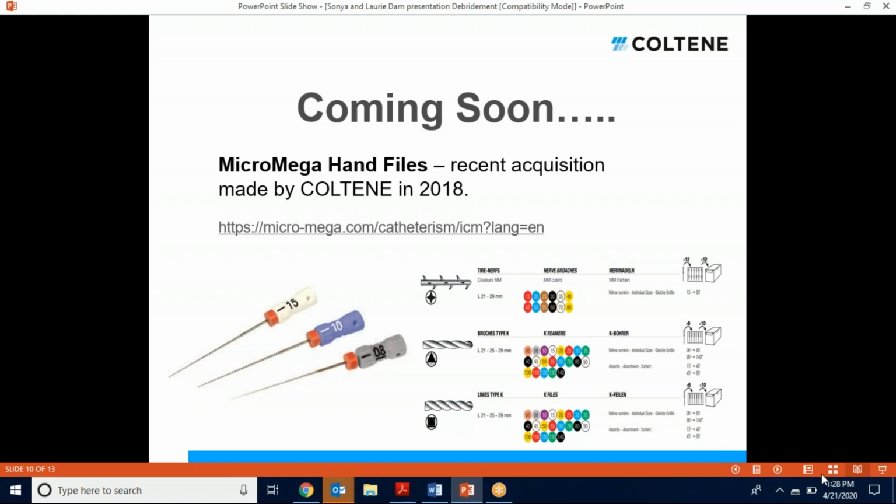All hand files have the ISO color coding, so it's great for easy recognition for the doctors. It's also good for us to know these, at least the most popular sizes, because if a doctor ever says, in which they do, I need a refill of your white hand files, then you automatically know, hey, they need a refill of the size 15s. So it's just good for everyone all around that these are all ISO color coded. Next slide, please.